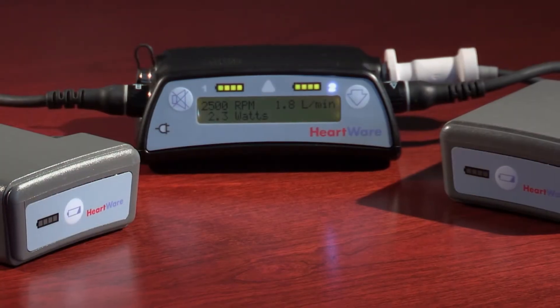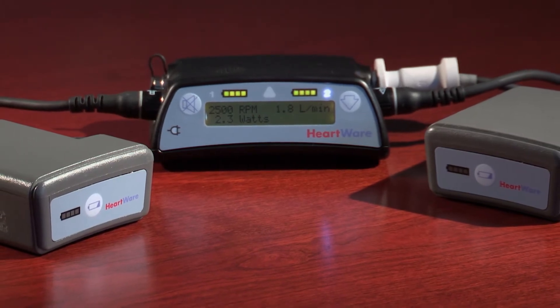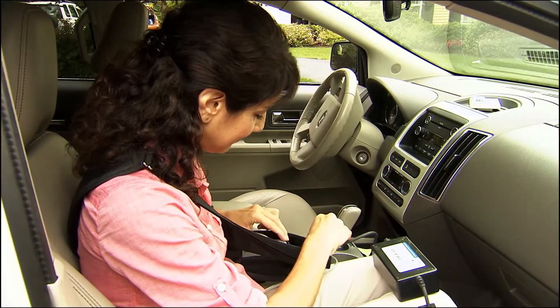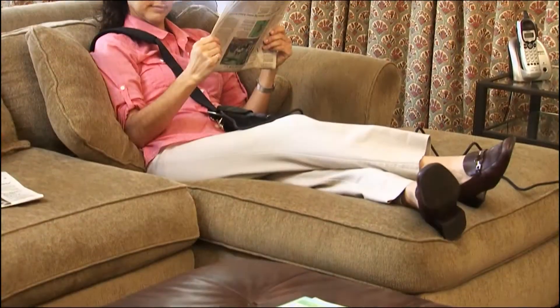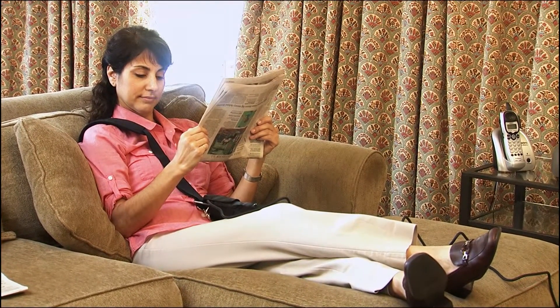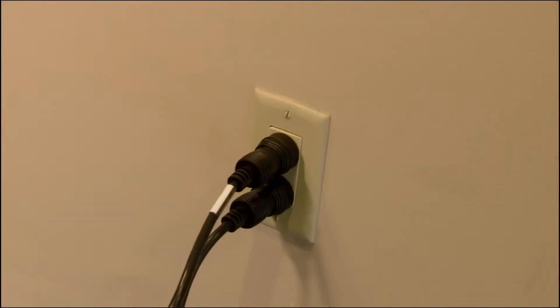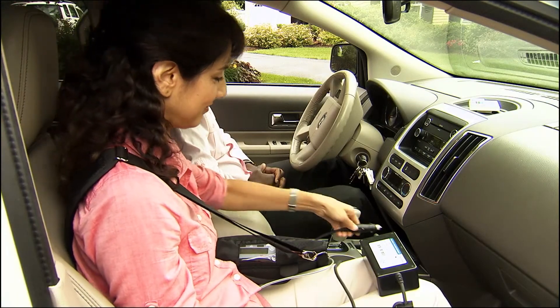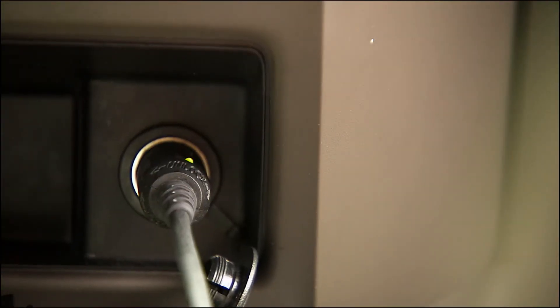The controller requires two power sources at all times for safety — either two batteries, or one battery and either the AC adapter or DC adapter. While active, a patient will typically use two batteries. While relaxing or sleeping, the patient would typically use the AC adapter, which provides power from an electrical outlet for an unlimited period of time. The DC adapter draws power from an automobile's electrical outlet and may be used when traveling by car.